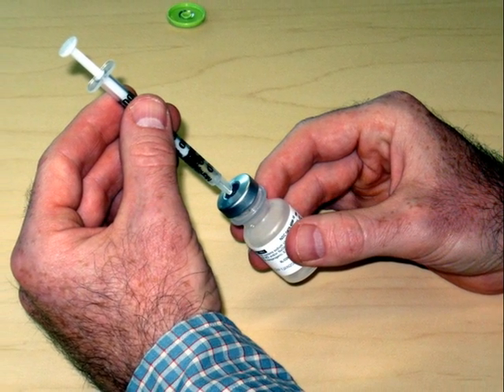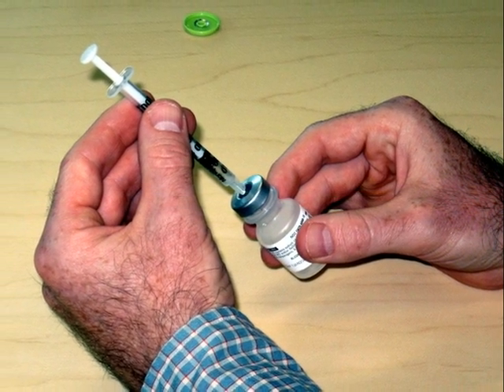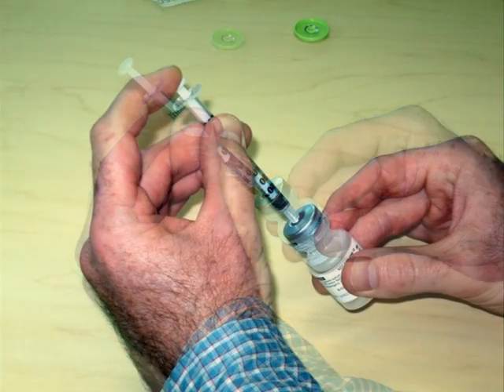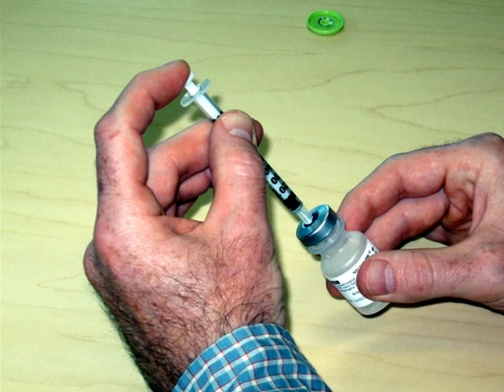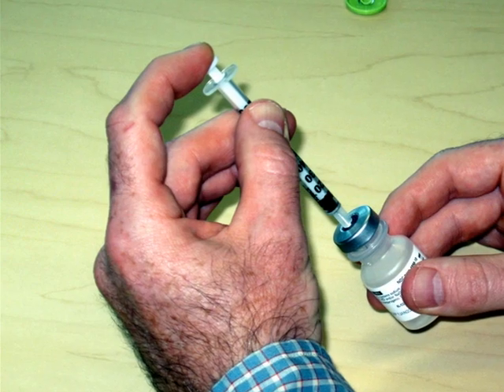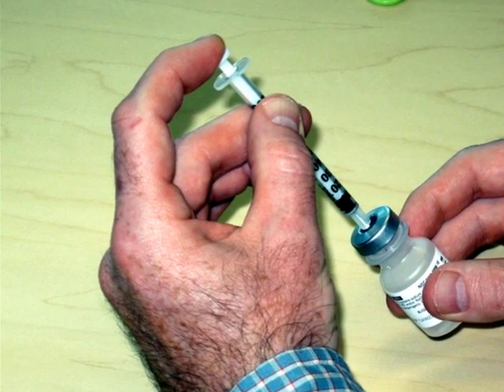Next, push the syringe through the stopper and inject the air into the vial. Air is injected into the vial because this makes it easier to draw up the insulin, especially as the vial nears completion.